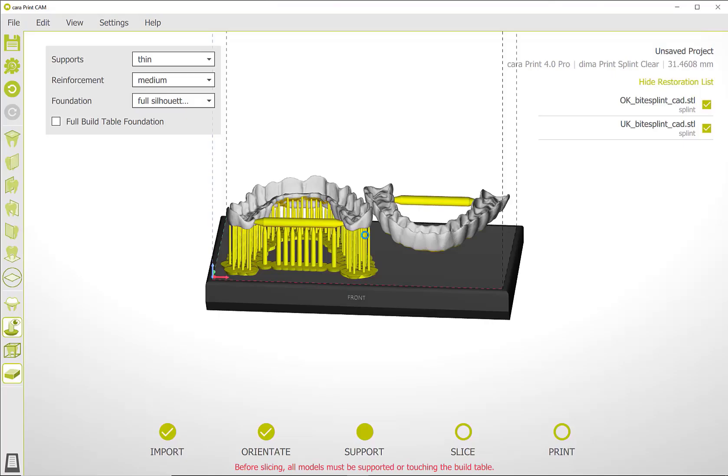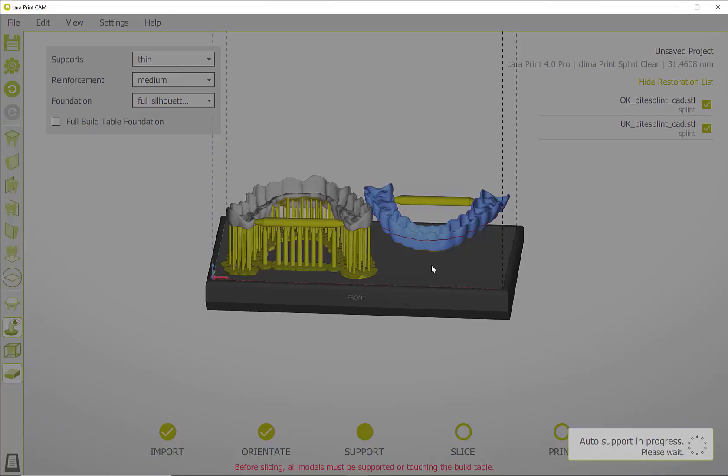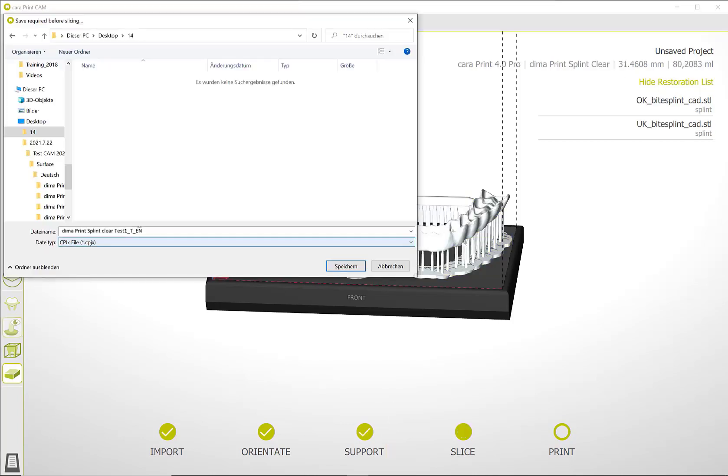If desired, you can also place a base plate under the object. Proceed in the same way with further objects. Once all objects are connected to the build platform, you can switch to the slicing step.